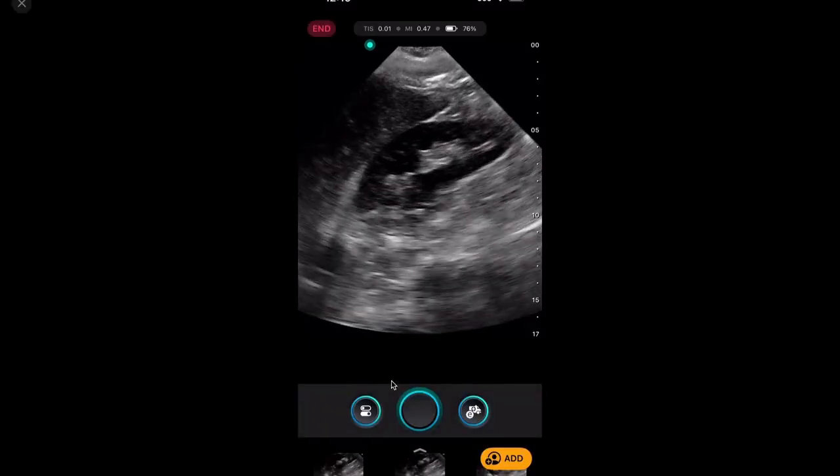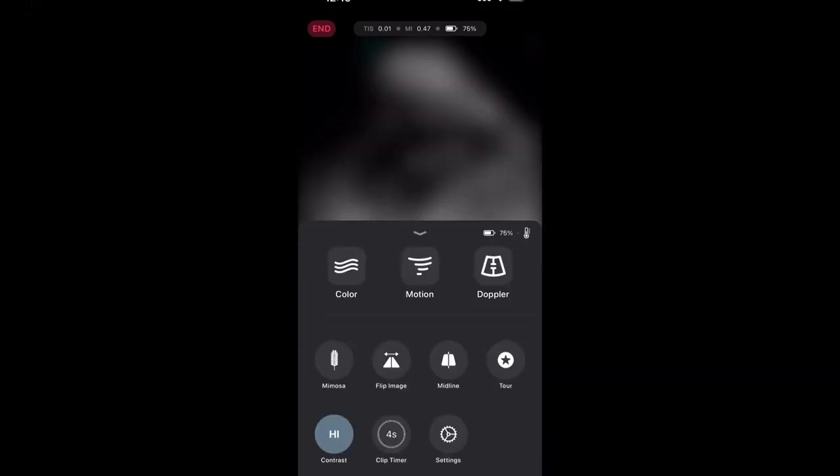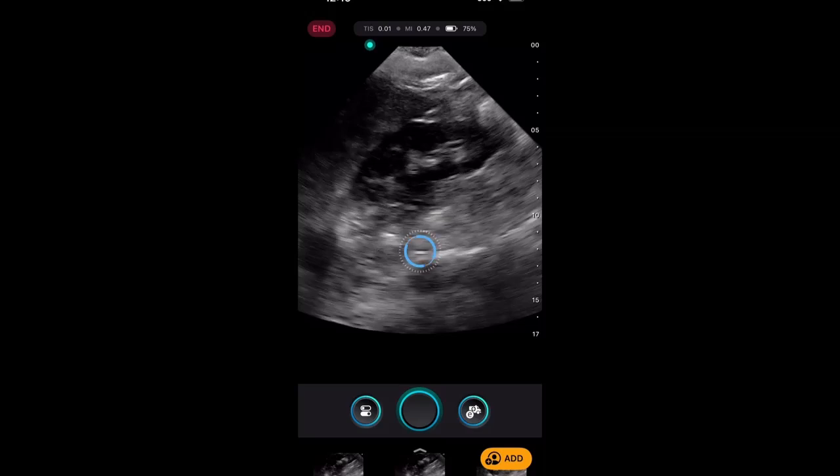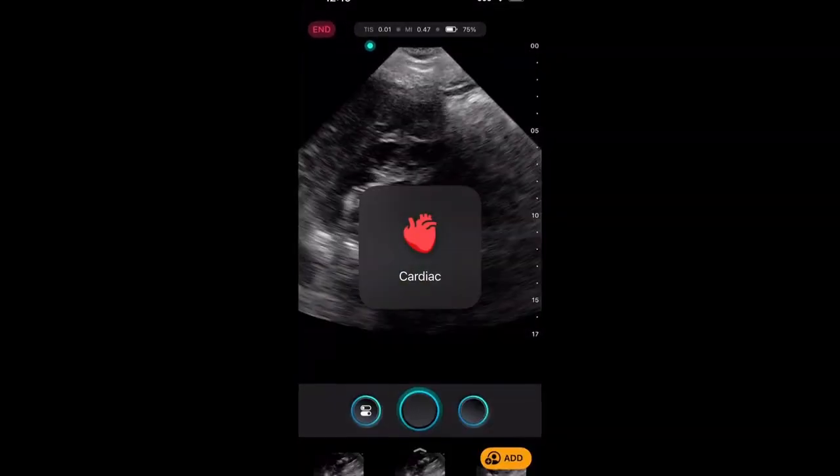Pressing the bottom button pulls up different options: color, M-mode, Doppler, image flip, settings, and a tour that provides an intro to the machine. Everything is available there. Now let's swipe over to the cardiac preset, because that's where a lot of the fun AI lives.